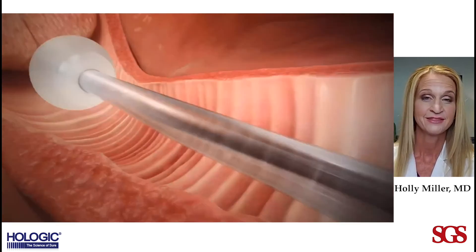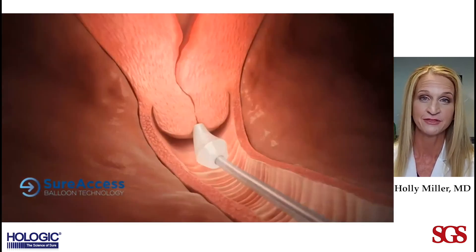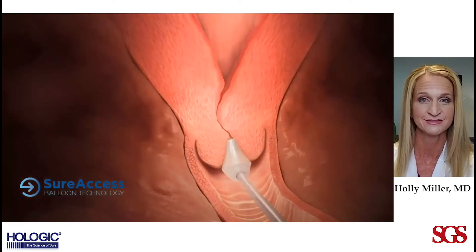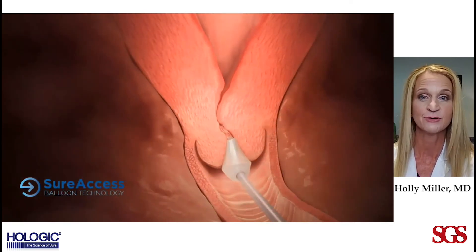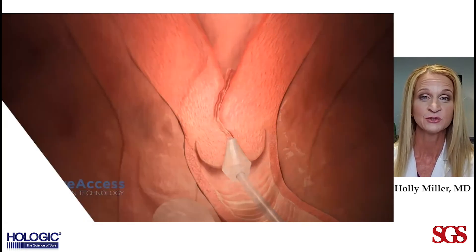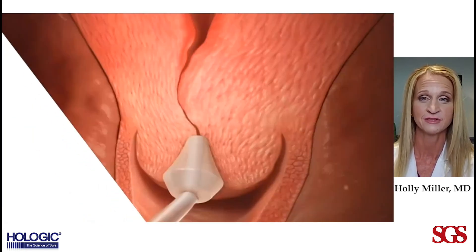The acorn tip of the dilator catheter is placed up against the cervix. The membrane is then rolled into the cervix by pushing the proximal and distal handles of the dilator catheter together.